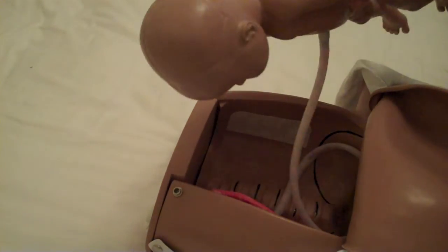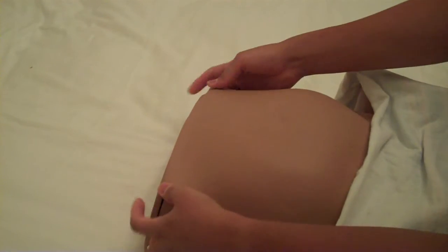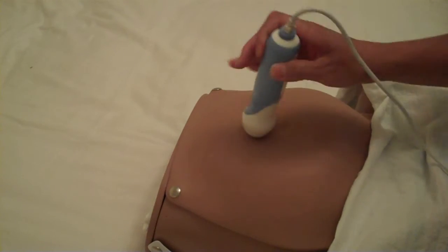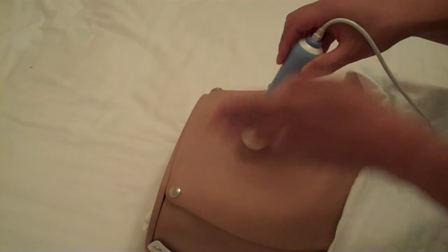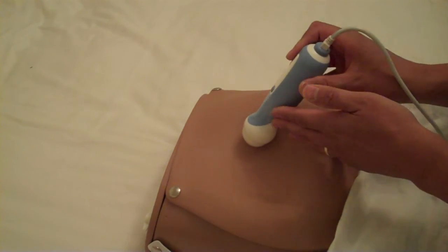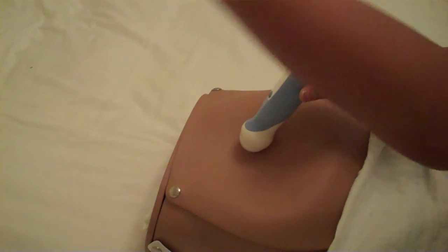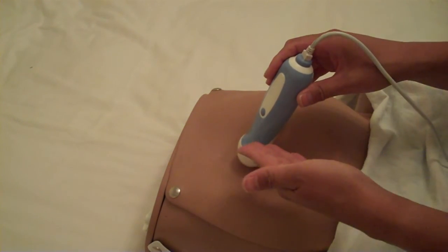So again, this is very important because obviously you're not going to be able to see inside the mother's body. Otherwise, we don't need an ultrasound. So what you need to be able to do is, as you move the probe and as you turn and as you see different types of images, you have to be able to figure out from what you see on the screen and where the dot is, how the baby is lying.